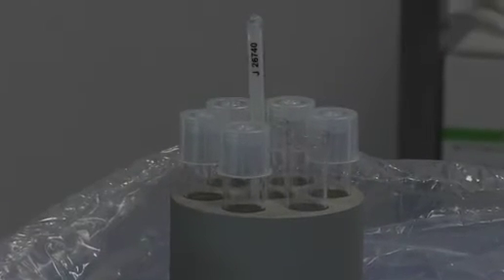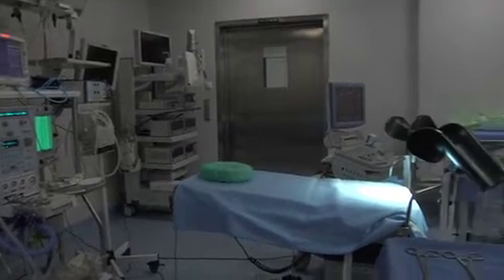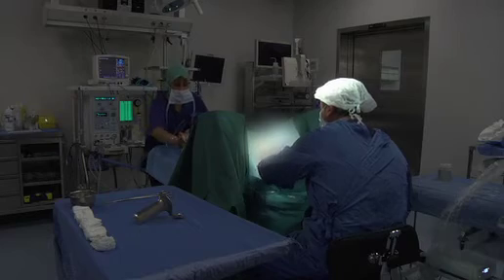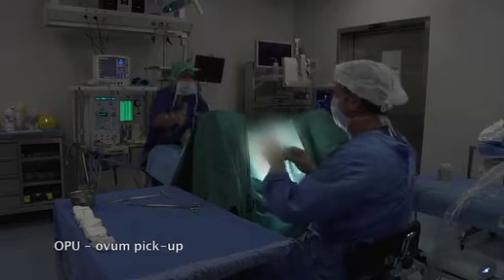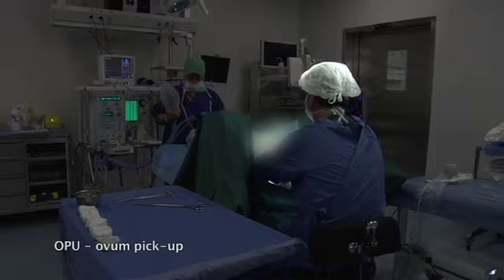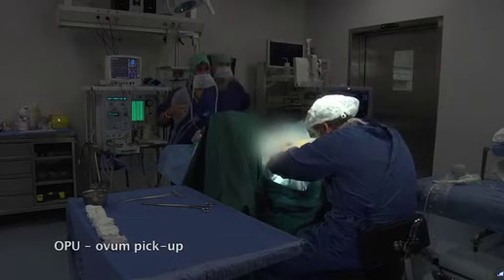The operating theatre is completely dedicated to IVF. The air atmosphere has to be controlled and a specific cleaning procedure is performed which is not toxic for the cells. At this moment, the speculum is being put into the vagina and then the vagina is gently rinsed with sterile solution.